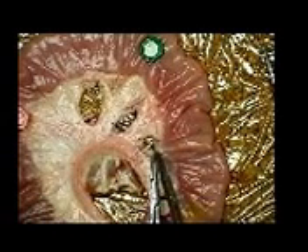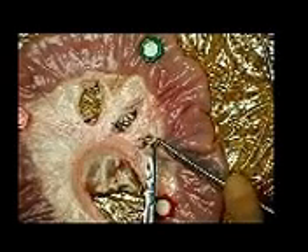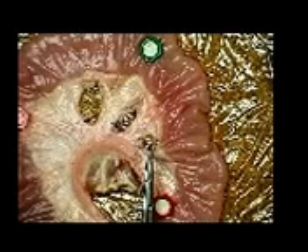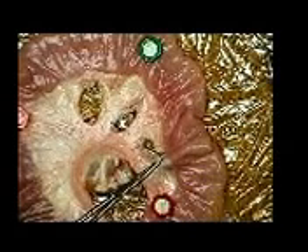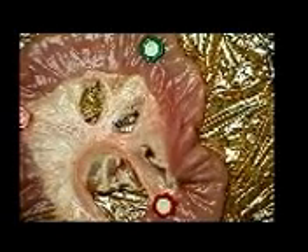The monofilament suture is cut, leaving slightly longer tails. The second method begins with the needle being passed through the pedicle as before. As the needle emerges, it is angled slightly away from you. Then forming a loop at the front of the pedicle, the needle is again passed through the pedicle with the point angled towards you as it emerges from the tissue. The loop of suture at the front of the pedicle is tightened down and the two free ends passed beneath the hemostat. The first throw is made and the hemostat removed. Further throws are made to complete the knot, creating a figure of 8 transfixion of the pedicle.